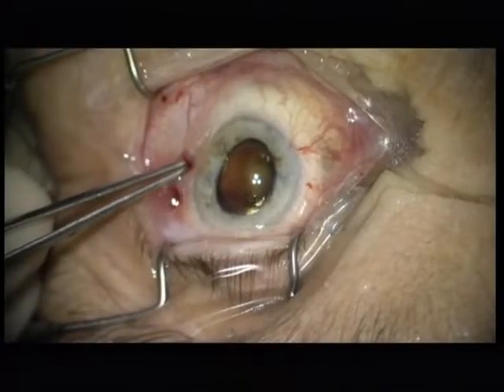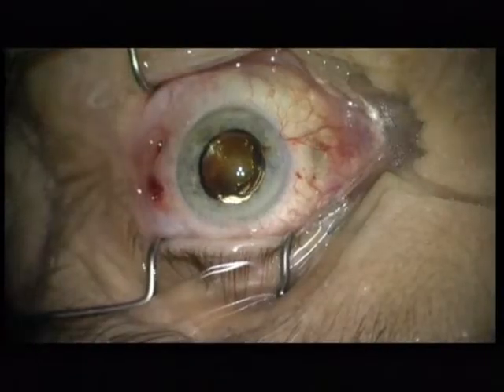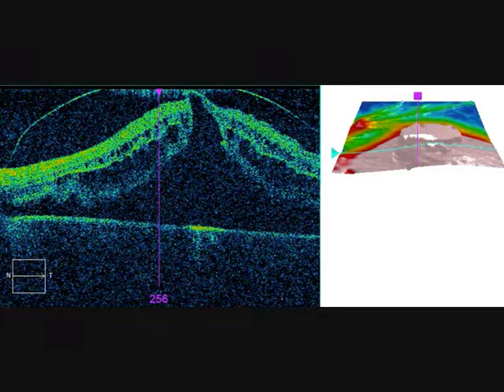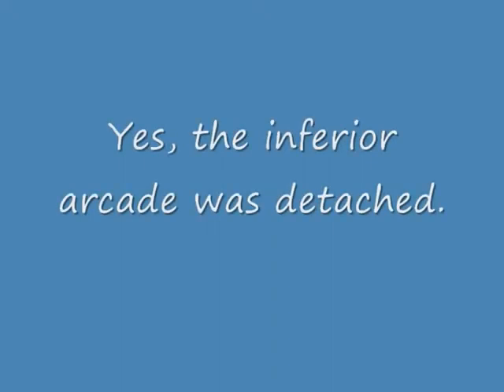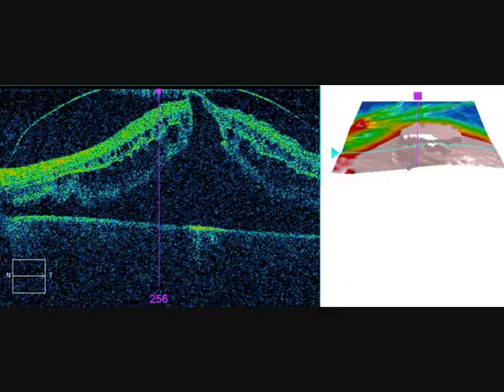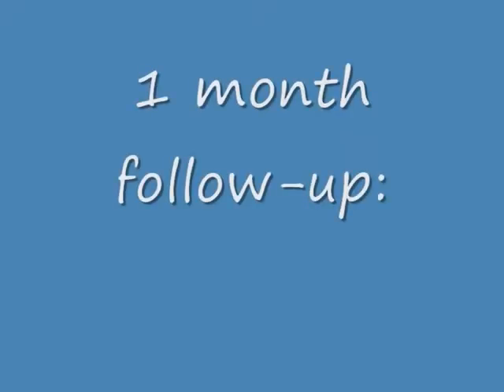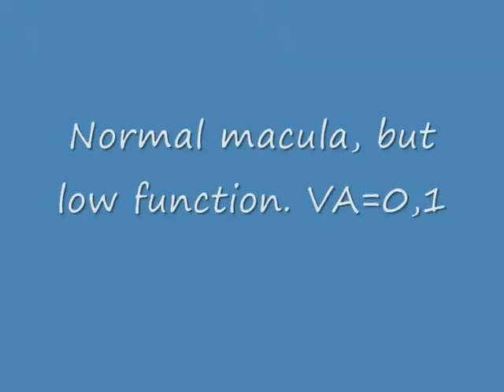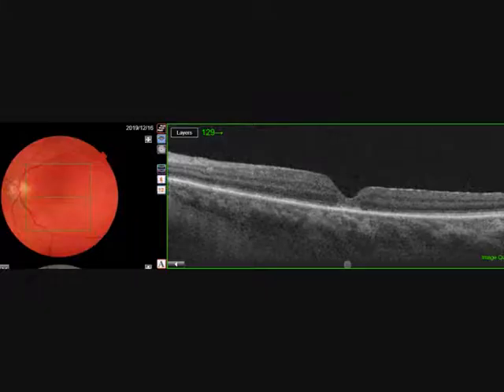And that is the case. Let's have a look at the post-operative follow-up. I looked once more at the OCT from the surgical day — and yes, the inferior arcade was detached. You see this is a broad detachment. And now comes the one-month follow-up, and it shows a completely attached and nice macula, but function is low: 0.1.